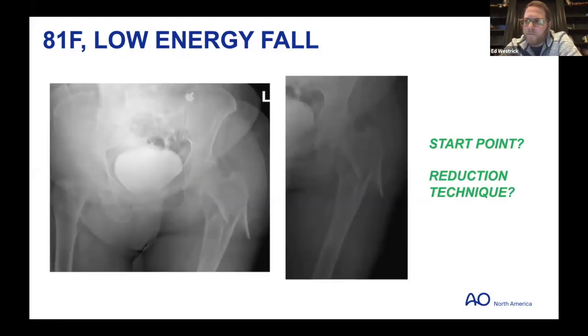Large patient, segmental injury. You can see the spiral extending down the shaft. I felt closed reduction or percutaneous reduction would be really unsuccessful in this patient at obtaining all those alignment parameters that we talked about. So I planned for an open reduction from the start. Based on her size, many might think that the greater troch start point would be easier to obtain and the preferred option.